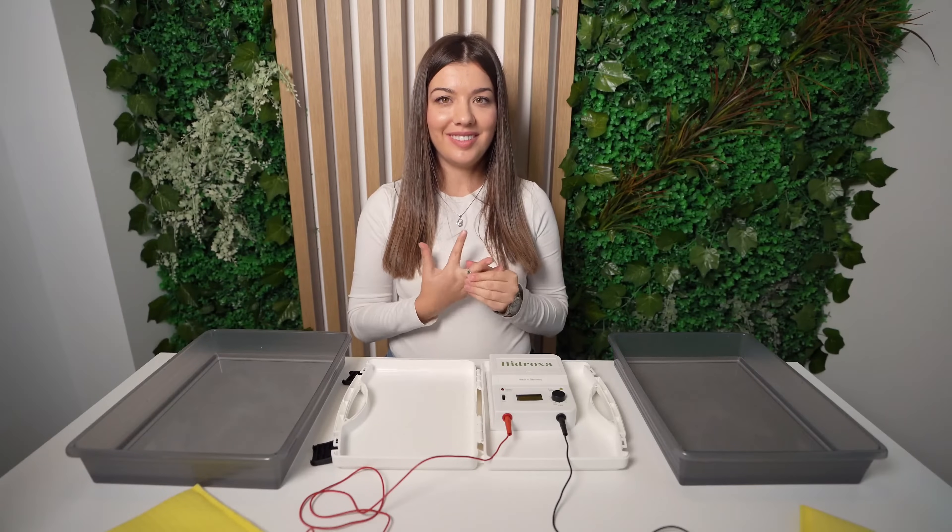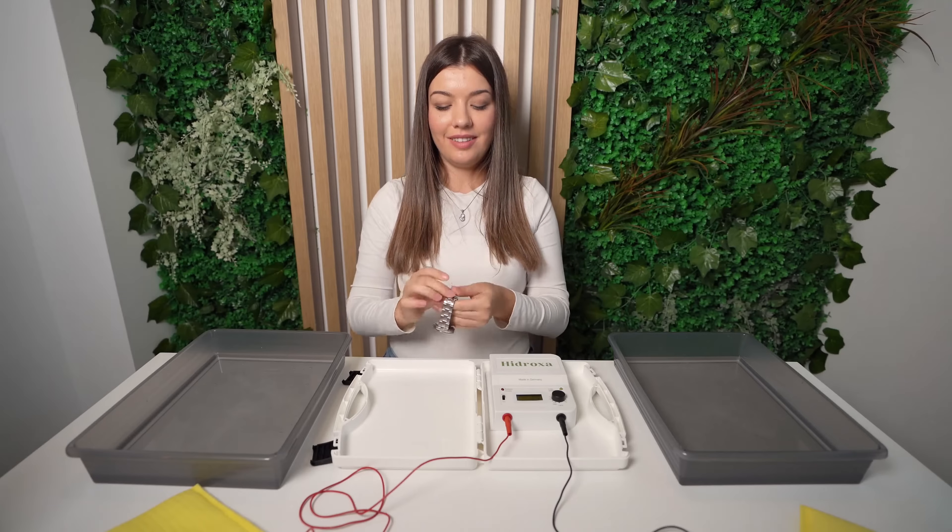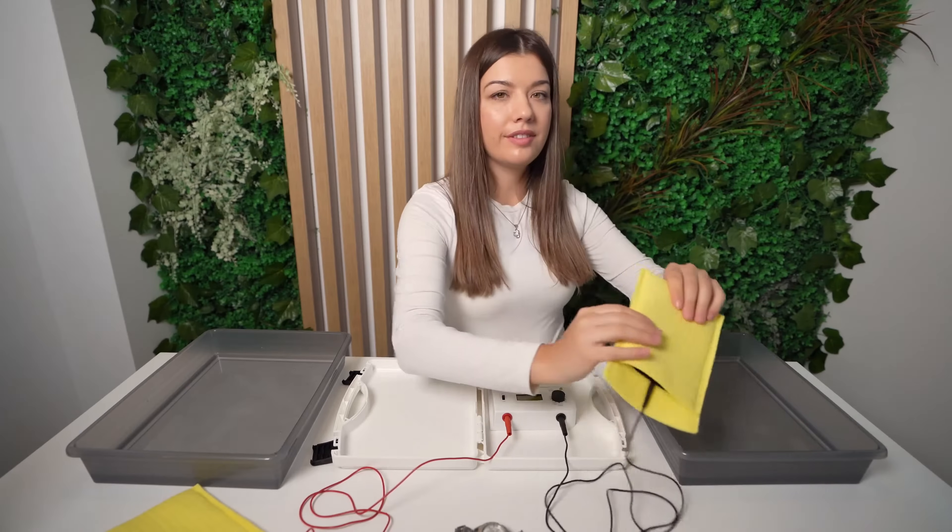Do not forget to remove all jewellery, piercings and clothing with metal details before starting treatment. Now, place electrodes in each container.